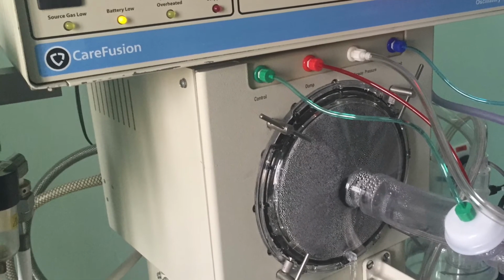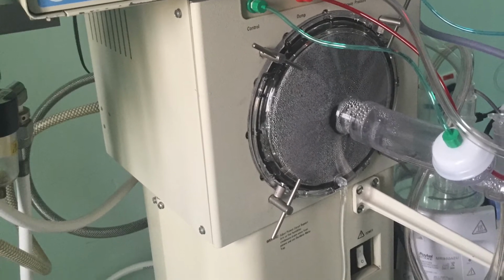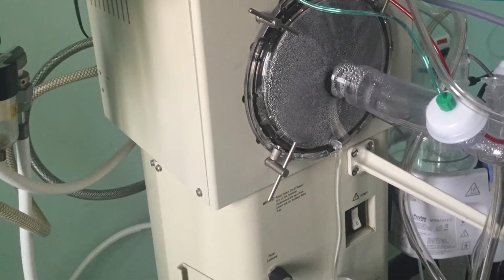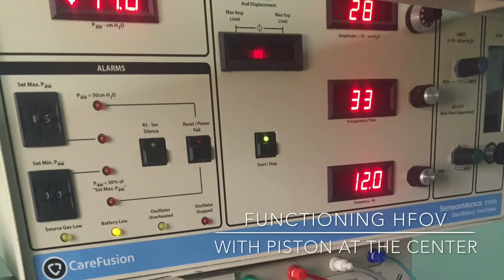In high frequency, it is important, aside from setting the parameters, to assess the chest wall symmetry and vibration, and also to maintain the piston at the center.